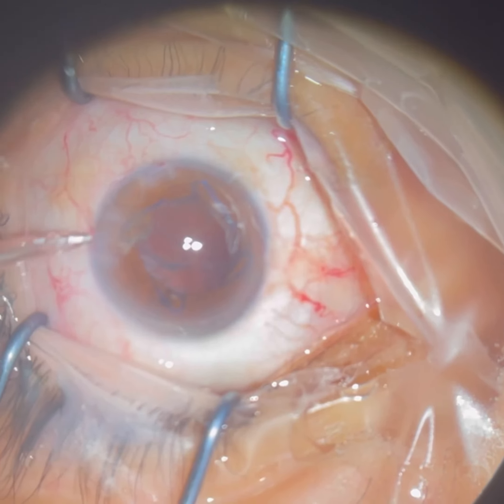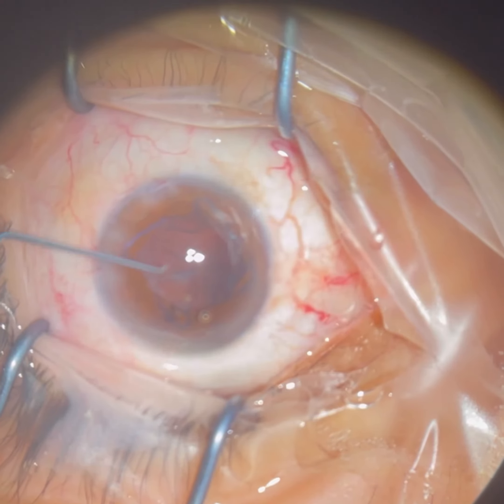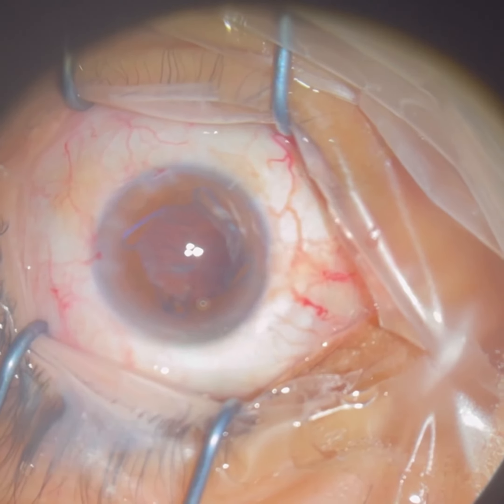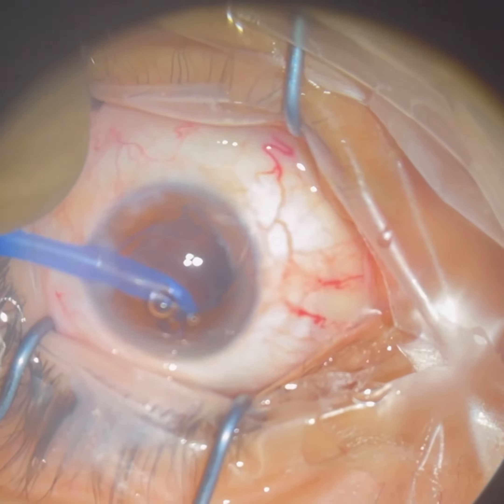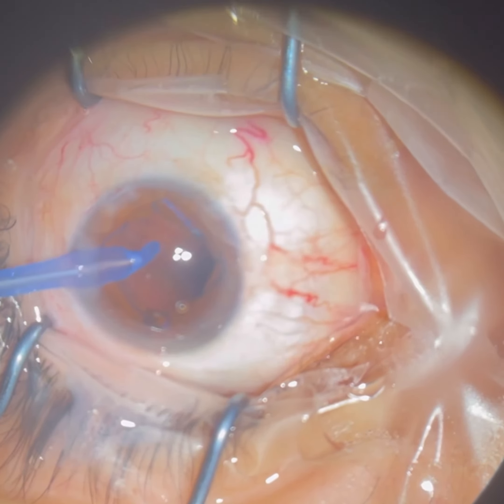Now there is some residual material that's left, so we're going to clean that up. We use multiple different devices — this one has a soft silicone tip so that we don't create any damage to the eye.